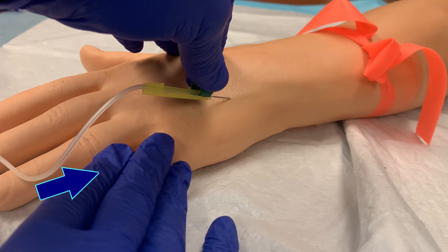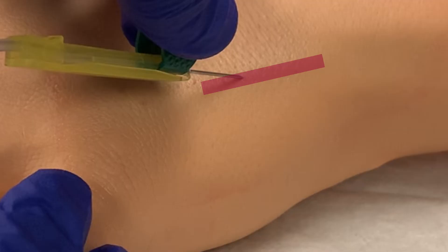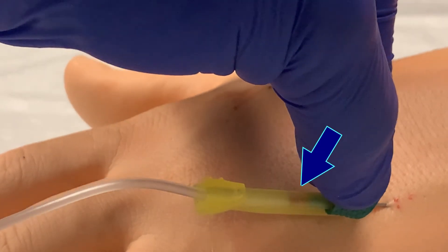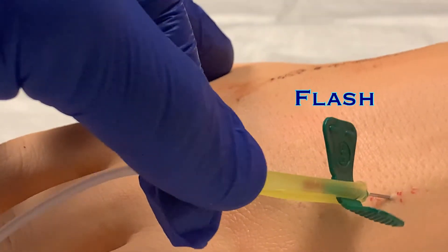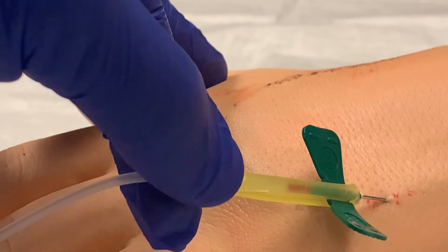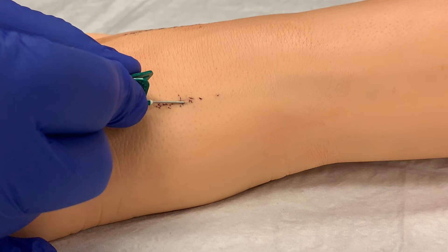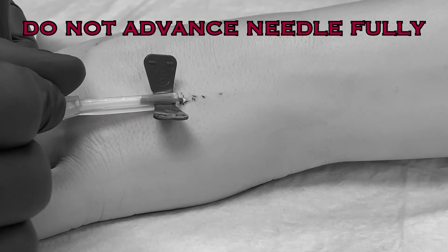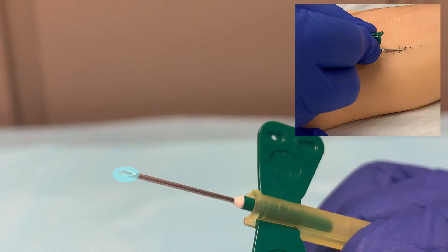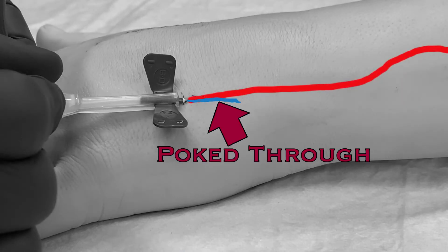Always insert the needle pointing up the arm, toward the heart — never insert pointing down toward the hand. Angle the needle about 30 degrees to the patient's skin. Line up the needle with the vein and insert the needle until you see blood enter the tubing. This is referred to as the flash. The flash is visible through the yellow hub, and when you see the flash, it means that you have pierced the vessel. Decrease the angle slightly and advance the needle another millimeter or two to ensure that you are completely within the vessel. But you do not need to advance the entire needle into the patient — you only need the beveled end to be completely within the vessel. If you advance too far, you will likely poke through the opposite side of the vessel and the vein will be blown.